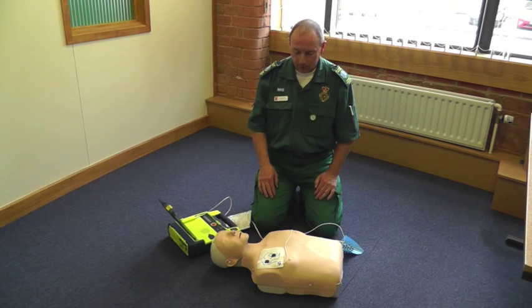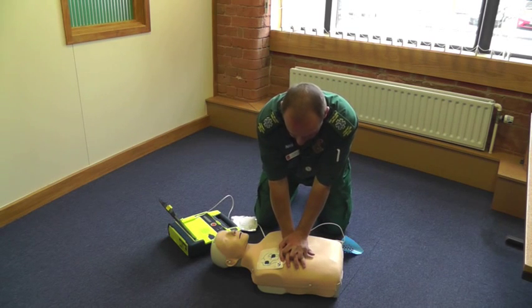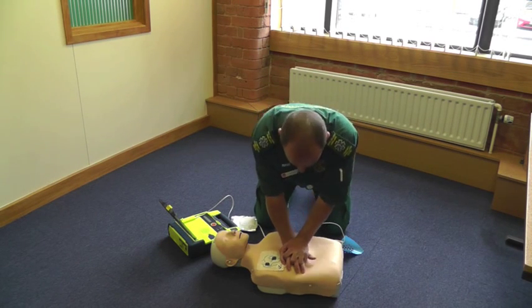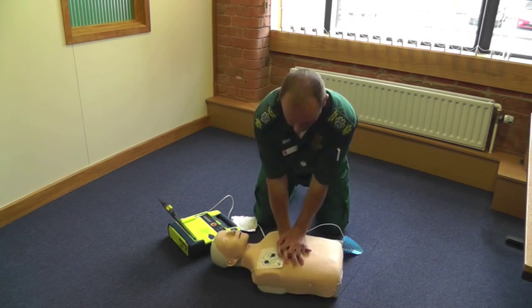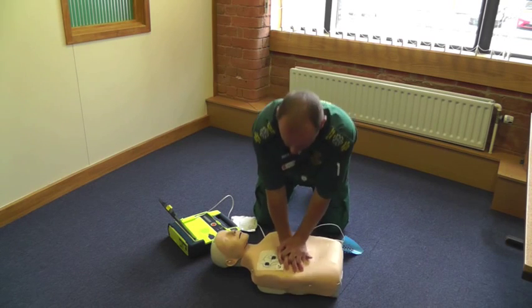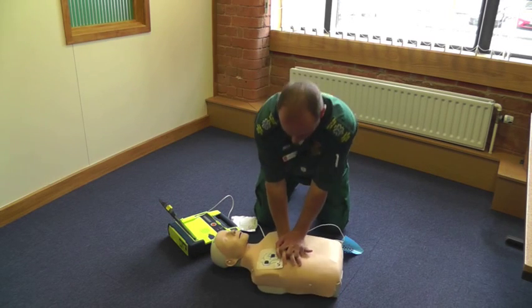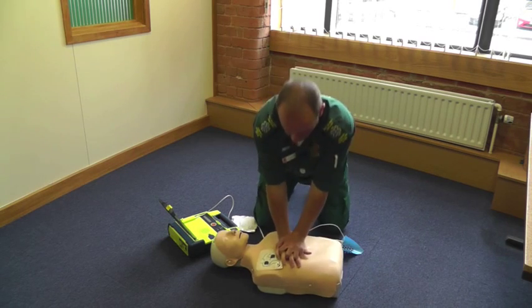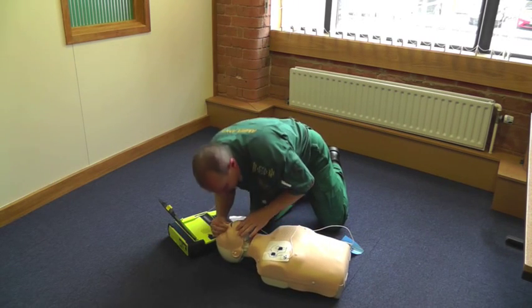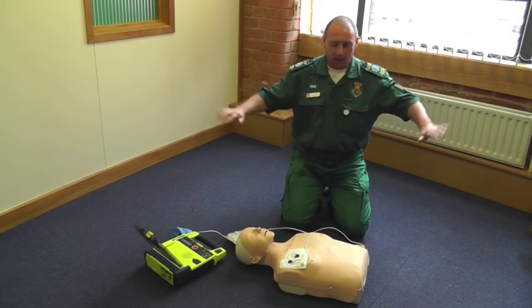It is now safe to touch the patient. Give 30 compressions, then give two breaths. Start CPR.